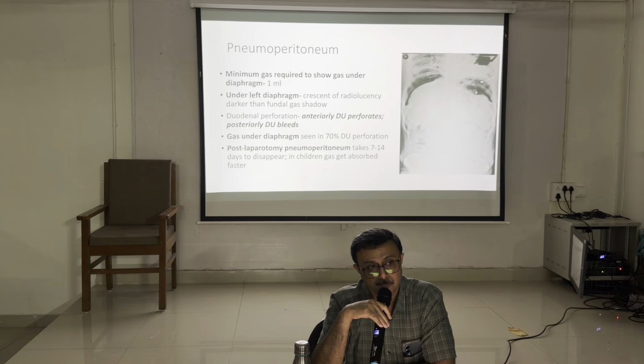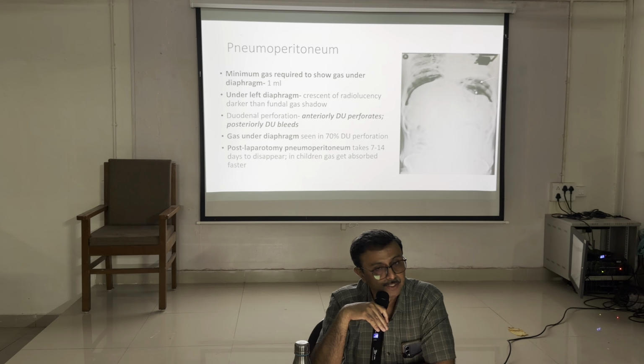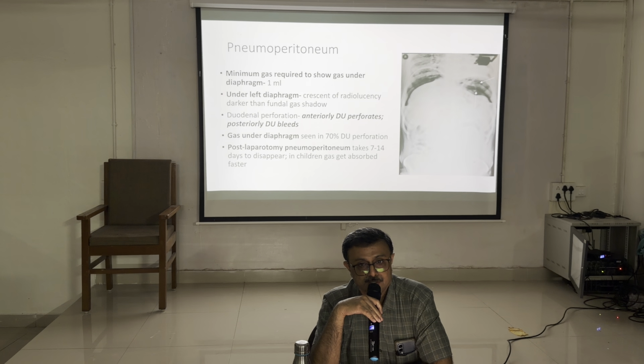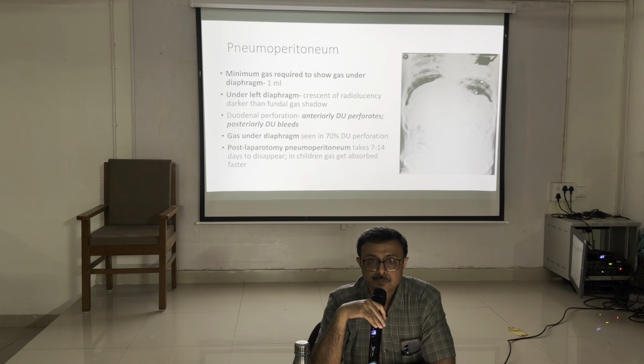Free gas might be there. In appendicular perforation, gas may not be there. Even though it is a perforation of a hollow viscus, there may not be gas. But yes, if there is gas, it is under pressure and there will be a huge gas shadow, if there is a gas-forming organism, anaerobic infection, because anaerobes are there in the bowel.